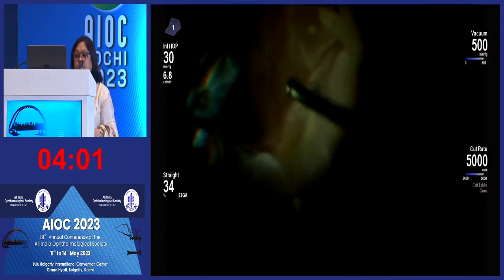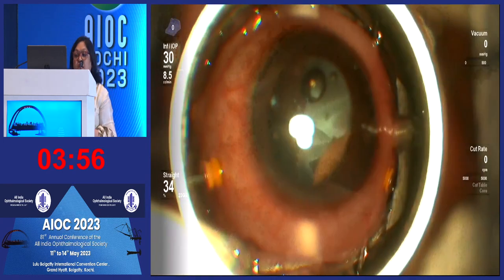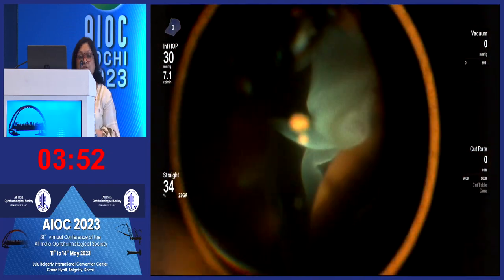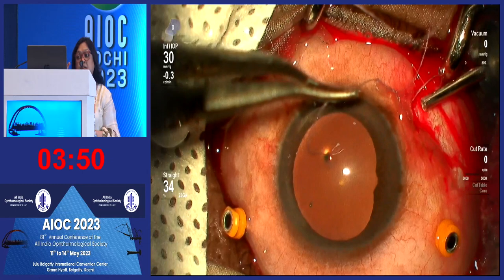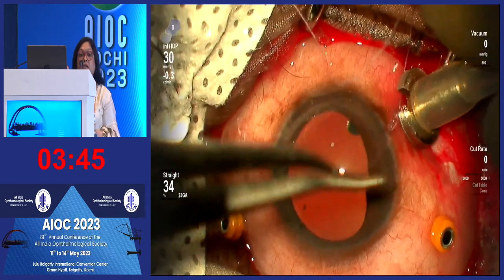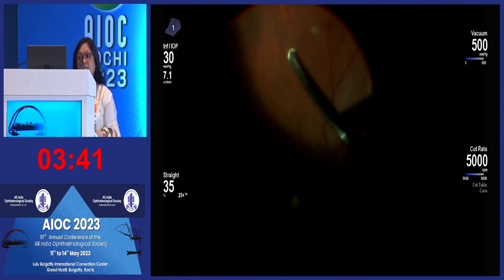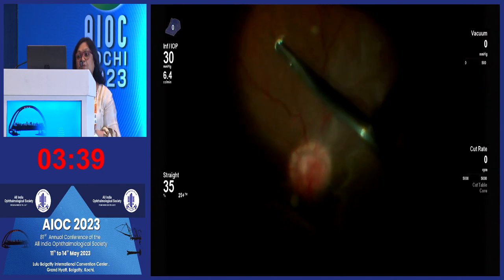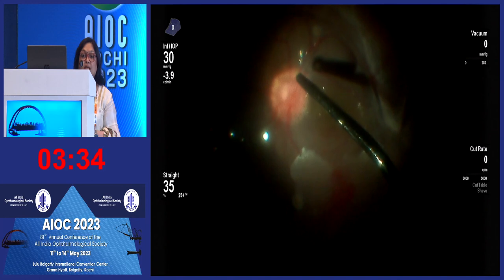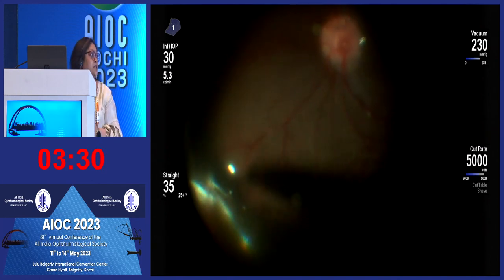Still, the cannula is placed in this position, but when the vitrectomy started, a large mound comes in and you realize the entire cannula is going subretinal. Just to tell you that some patients like these have the entire pars plana off in the area of the GRT, and you're left with nothing but putting a large, long 20 gauge cannula in such patients so that you can stabilize the globe and get your infusion right inside. Once that's done, you put in your PFCL to stabilize your posterior pole like your third hand. You flatten the edge of the GRT.